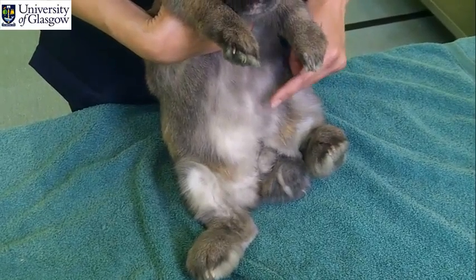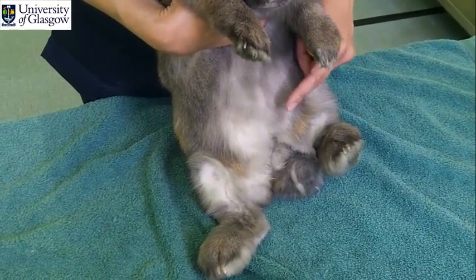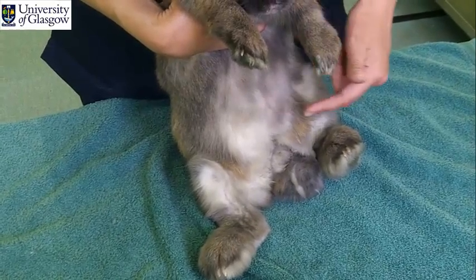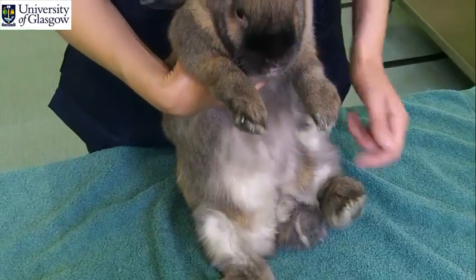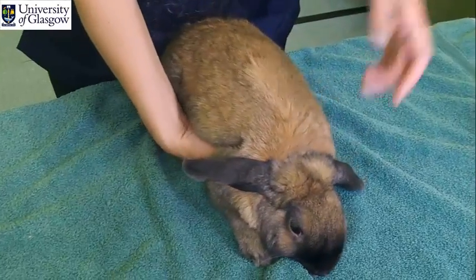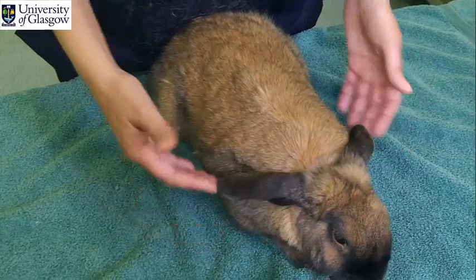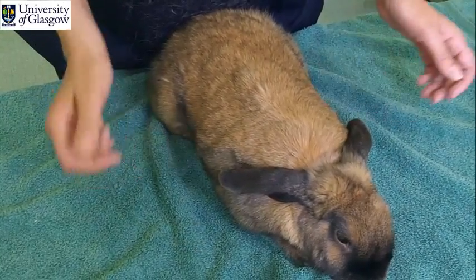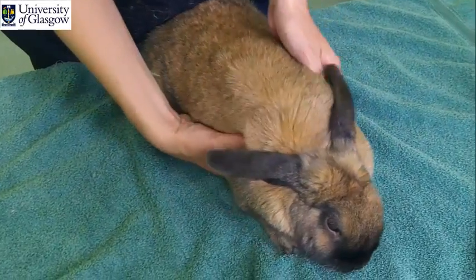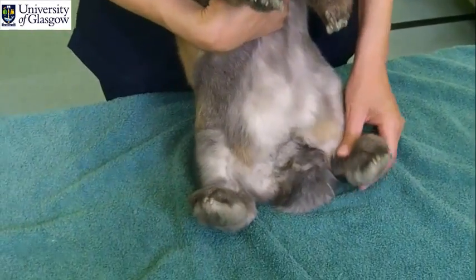However, this is a blind technique, and it can be dangerous because rabbits have a really well developed cecum, and if we insert the needle inside the abdomen, we do not know what we are touching. So before using the intraperitoneal injection, we should be sure that we have tried all the other routes in order to avoid any dangerous puncturing of the cecum.